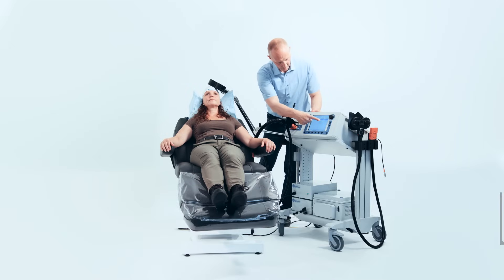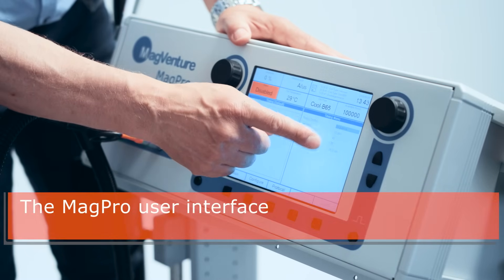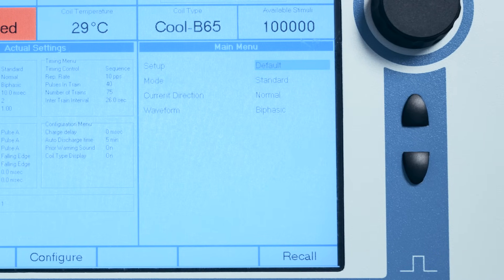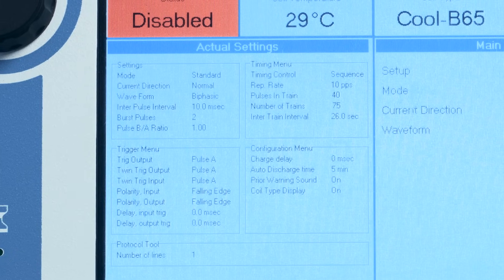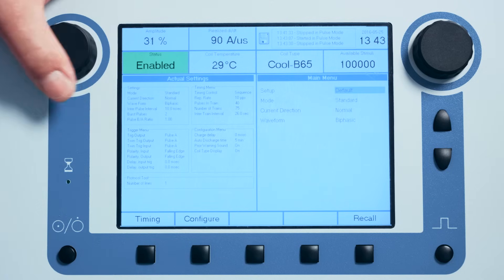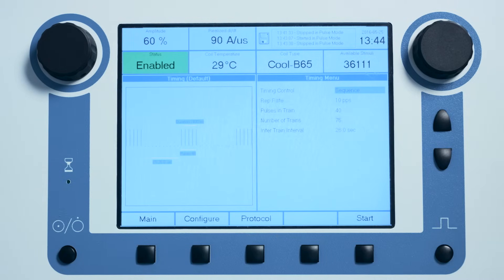MagVida TMS therapy systems come loaded with FDA and CE approved RTMS protocols as the default setting. Upon boot up, the stimulator loads the default protocol automatically. The user should double check the settings to confirm that the default protocol has been loaded correctly. After verification, the operator navigates the software interface to the timing menu, enables the stimulator, sets the correct intensity — the intensity corresponding to 120% of motor threshold — and depresses the start button.